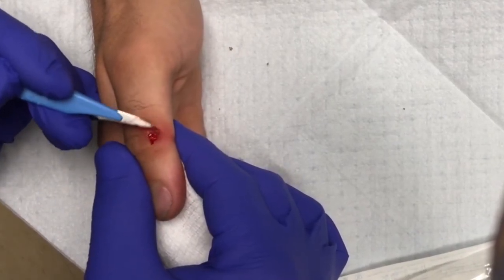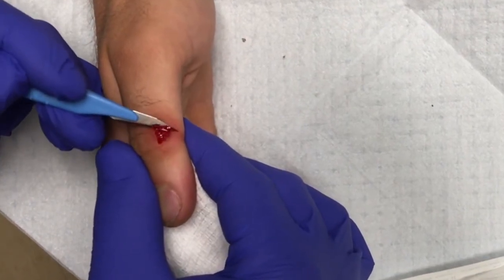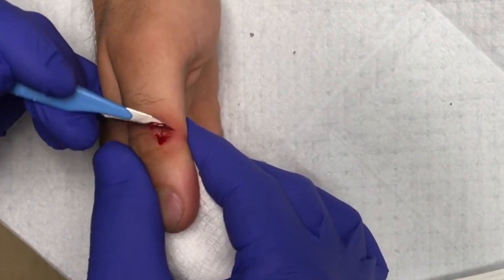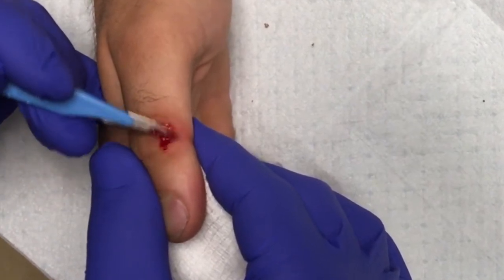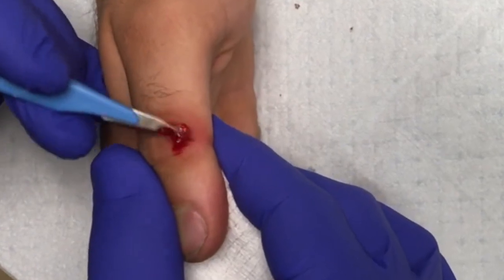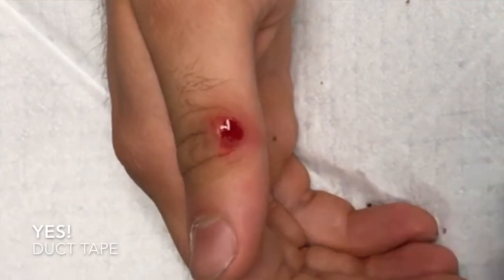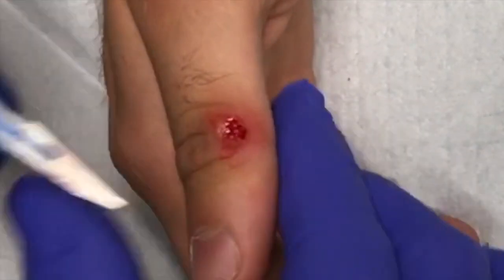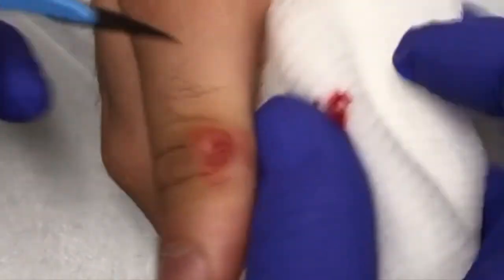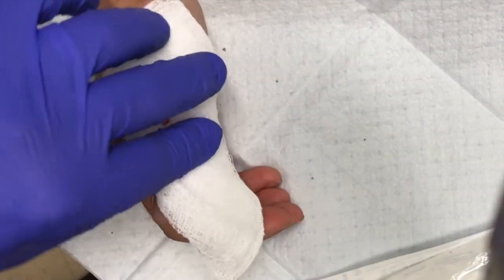Since you're not feeling it, I'll say I'm a sadist — we're going to keep going until you say ouch. This tends to need about three to four treatments every two to three weeks. In between treatments, you wear duct tape. There are a lot of studies showing the chemical on duct tape stimulates the immune system to come to the area and kill the wart.